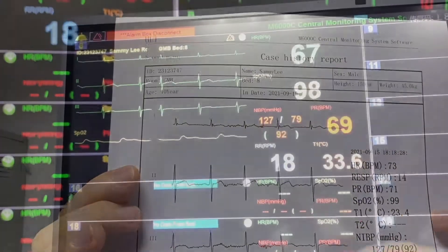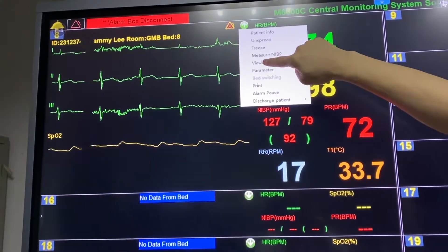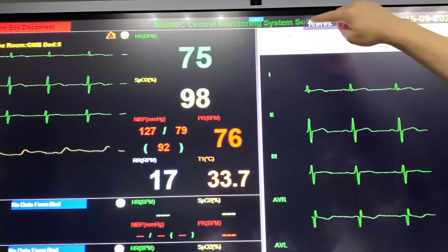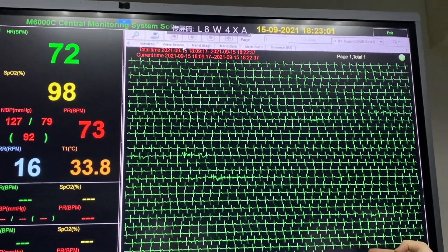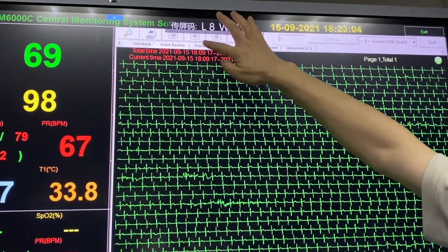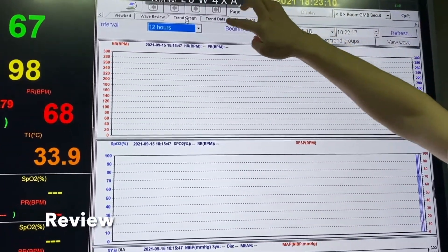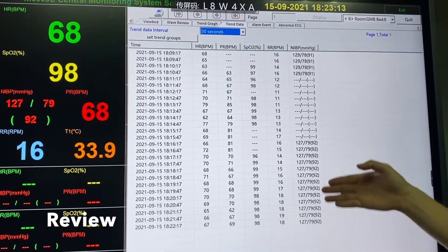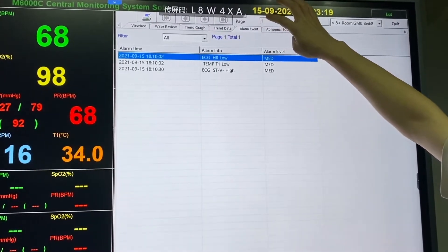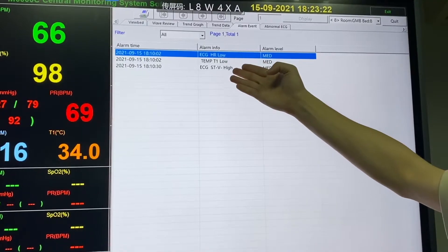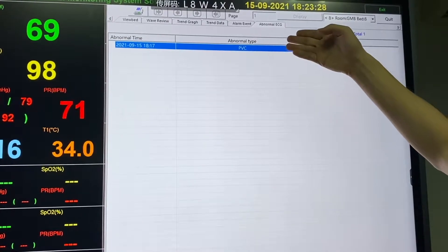Once we have monitored the patient for a period of time, we can go back and click 'view bed'. We can see waveform review and holographic waveforms. We can also see the trend graph, which is a summary including trend data such as blood pressure measurements. Alarm events are also recorded, including ECG, heart rate, temperature, and any abnormal ECG events such as detected PVCs.